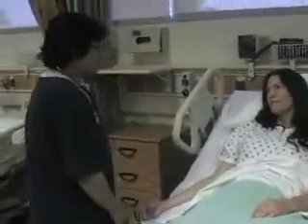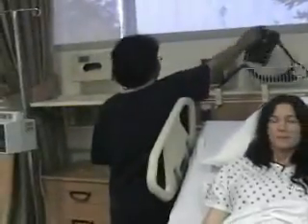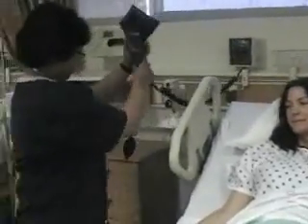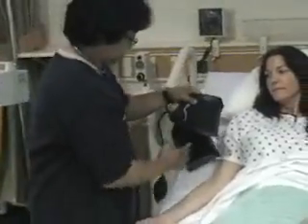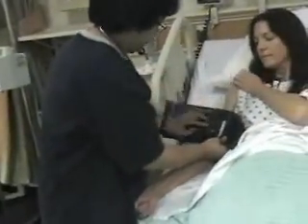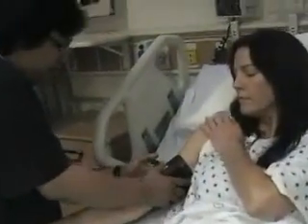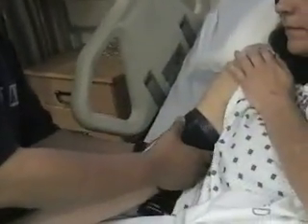Hi, Marie. I'm Helen. I'm just going to take a blood pressure. I'm putting the cuff one inch above the brachial artery.